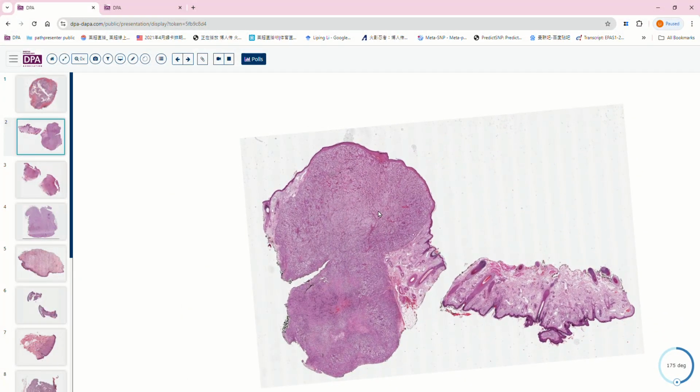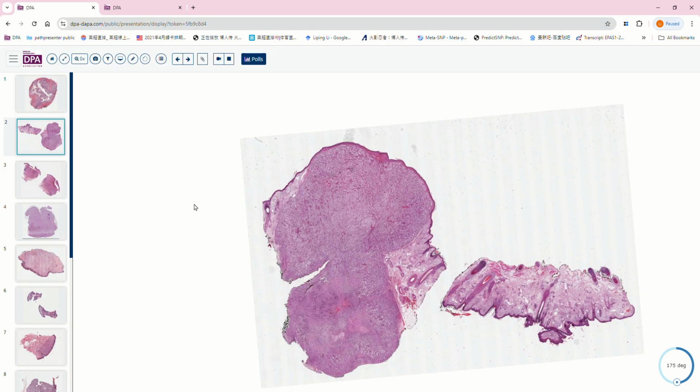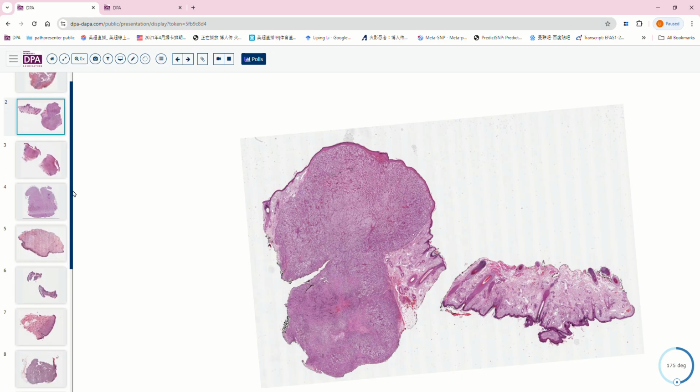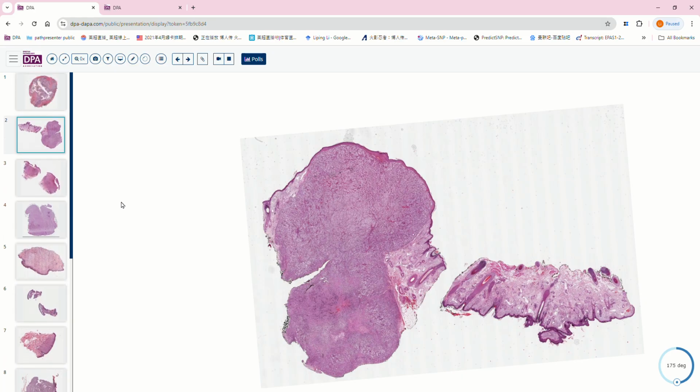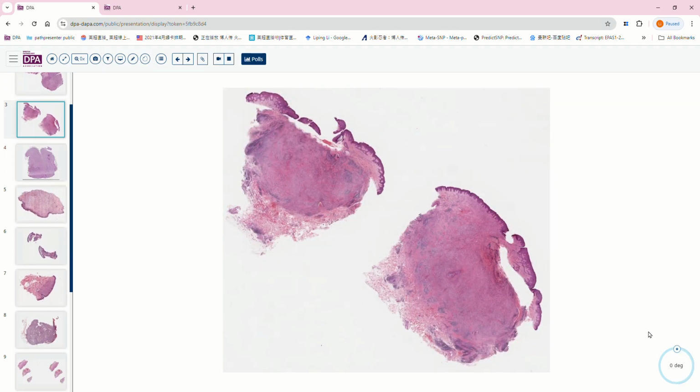Okay, and for another case, does anyone want to volunteer to pick whatever case they want? I can do one. Just pick whatever number you want. Do you want to just keep your screen? I think I'll just keep my screen. Okay, I'll do one. Which one is your favorite? Number 3. Oh, that's a good one.